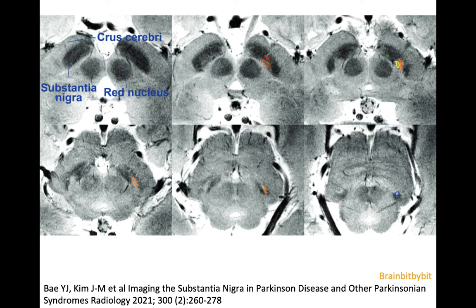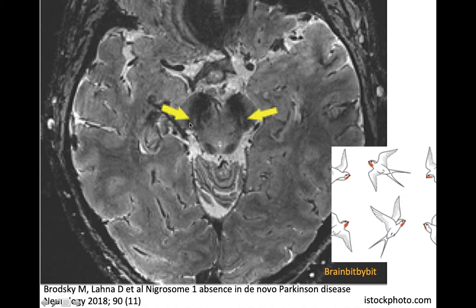The dopaminergic neurons are not distributed evenly in the pars compacta of the substantia nigra — there are nigrosomes where dopaminergic neurons are more concentrated. The largest is nigrosome 1, outlined here in orange. These are 7 tesla images going from cranial to caudal, and you can see five different nigrosomes. The substantia nigra extends very inferiorly, down to the level of the inferior colliculus, much lower than you might think. Nigrosome 1 gives the substantia nigra the appearance of a swallowtail on 7 tesla images, with a bifid dorsal part.